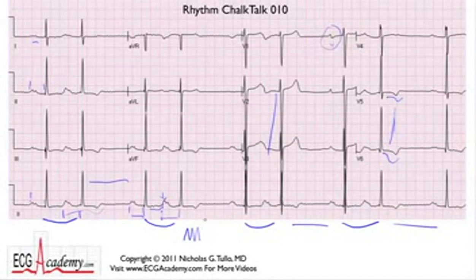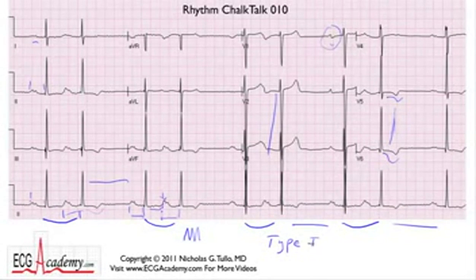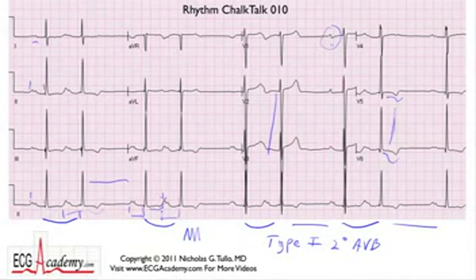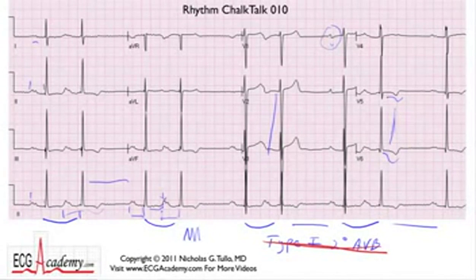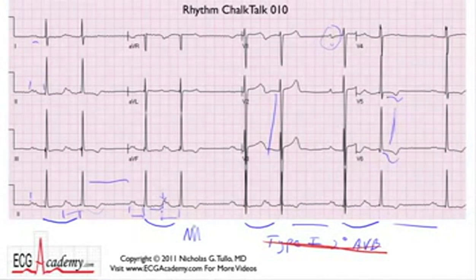This is probably Type 1 or Type 2? Type 1 second degree AV block. Well, if you said that, you are wrong. Fooled ya. So why isn't this Type 1 second degree AV block? Clearly the PR is getting longer and you've got group beating.